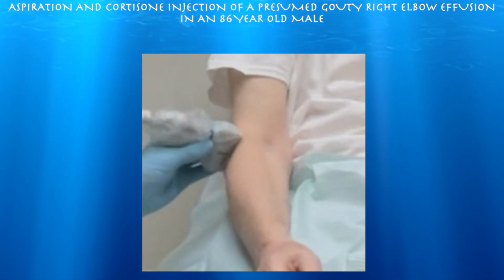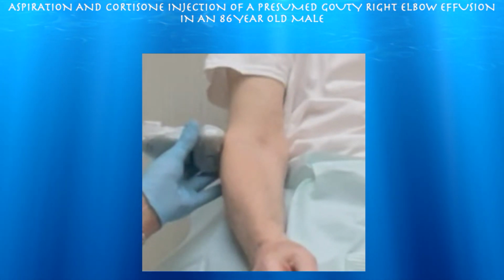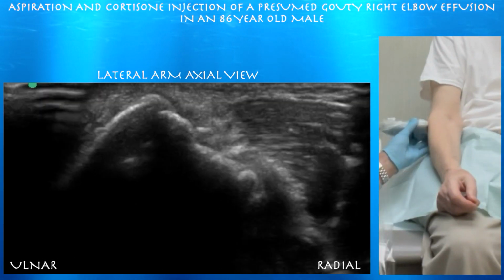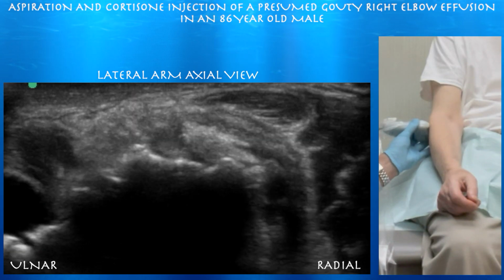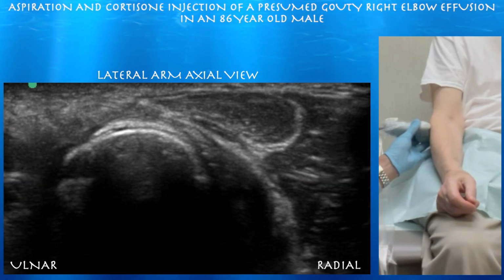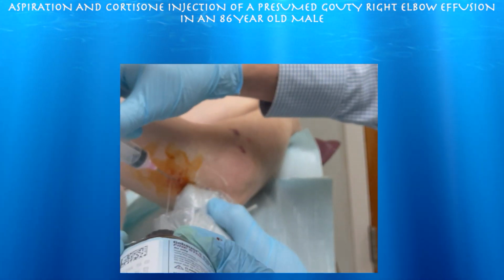Look at this now in a short axis view. Right side of the screen is going to be kind of radial. Here we're looking at the lateral epicondyle. You can appreciate the brachioradialis muscle to the right. Here we're looking at the common extensor tendon in cross-section. You can appreciate that tophus underneath it, between the common extensor tendon and the bone itself. Here it looks like the annular ligament is brighter than expected, so there may be urate icing of the annular ligament itself.